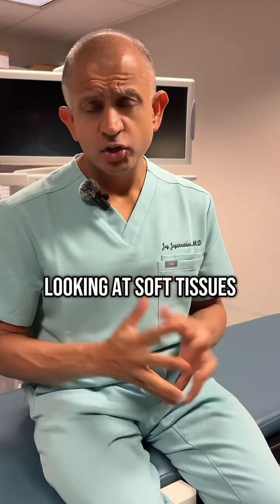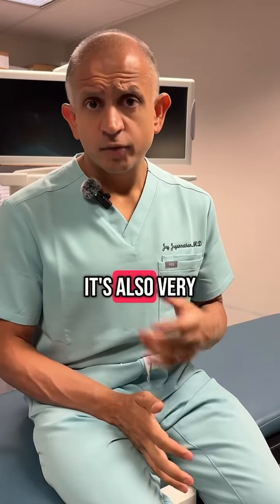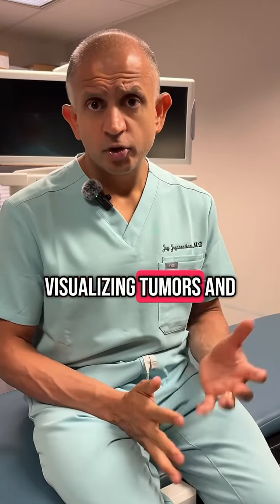So looking at soft tissues, looking at the brain, the nerves, the spinal cord, MRI is very effective. It's also very effective for visualizing tumors and things like that.